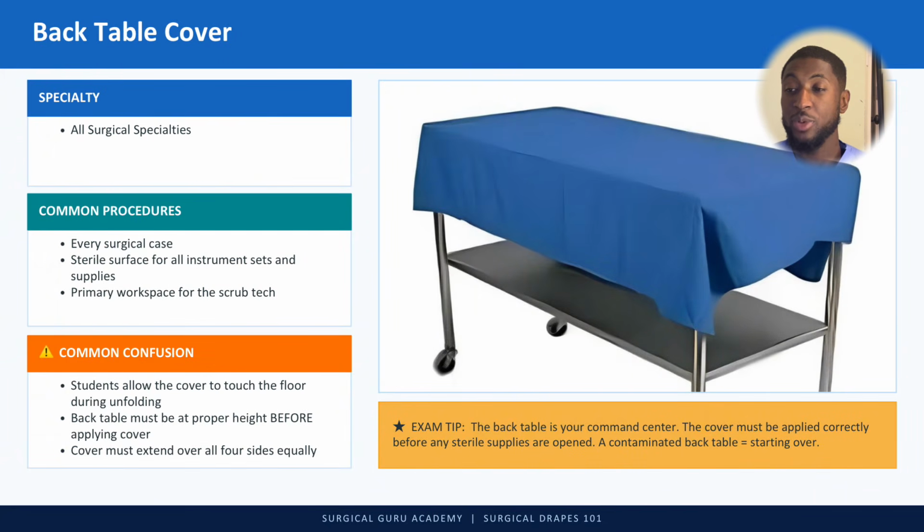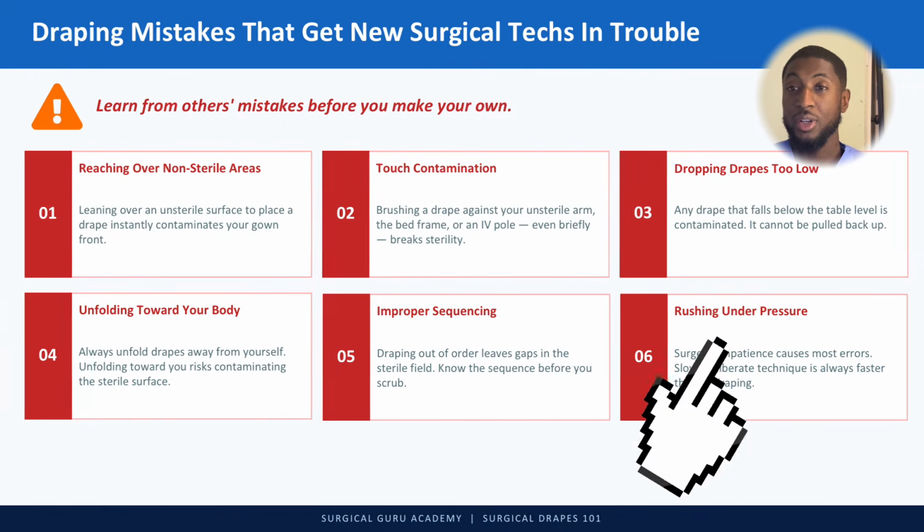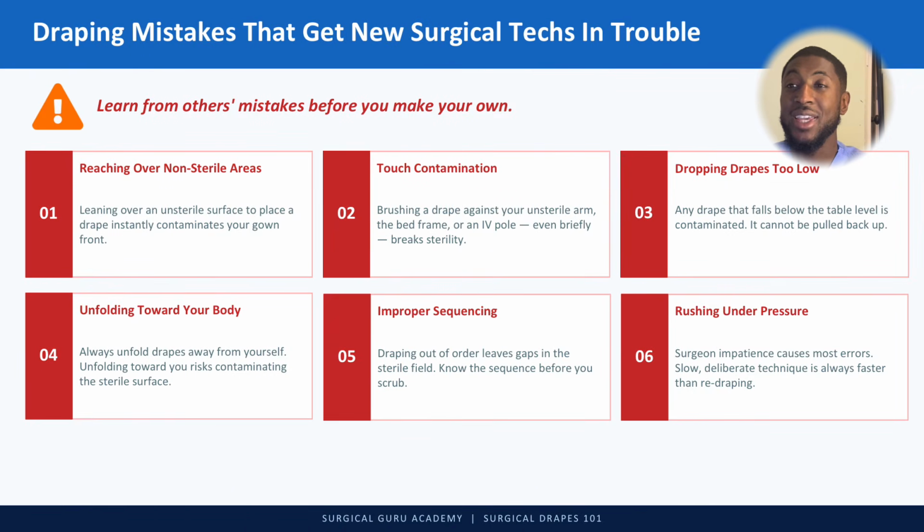Exam tip. The back table is your command center. The cover must be applied correctly before any sterile supplies are open. A contaminated back table means you are starting over. All right, so draping mistakes that get new surgical techs in trouble. Learn from others' mistakes before you make your own.